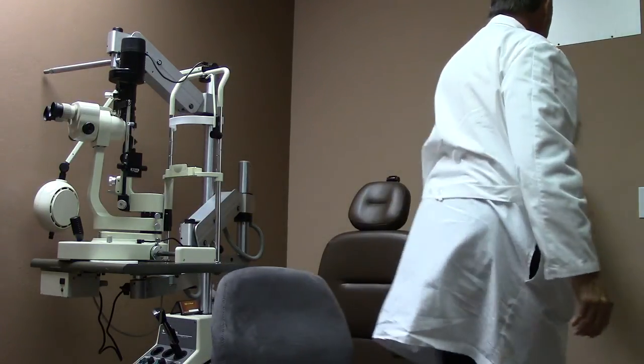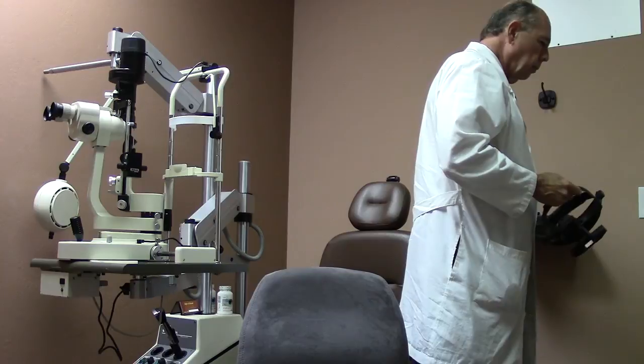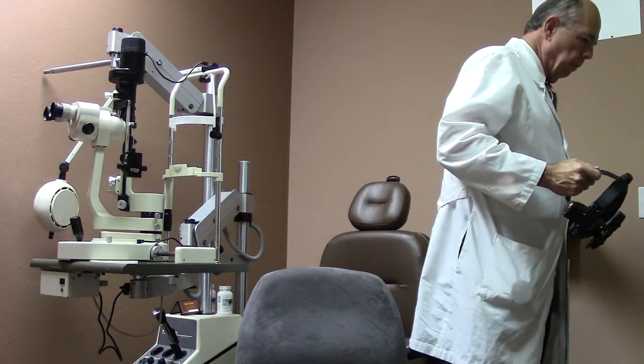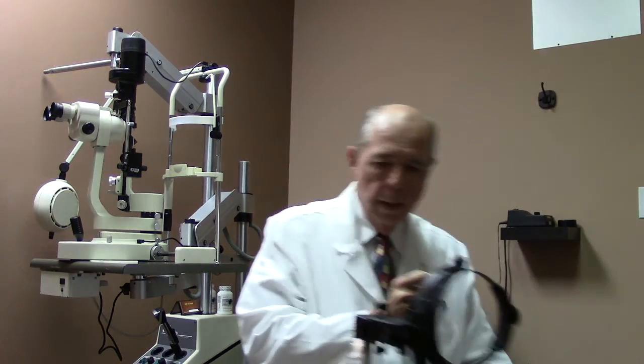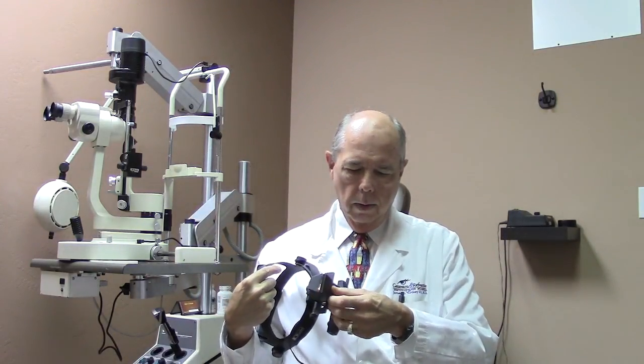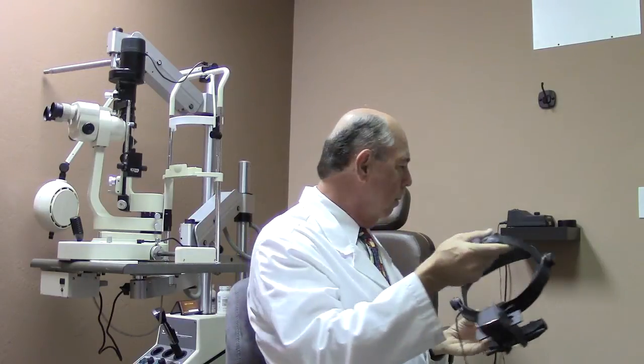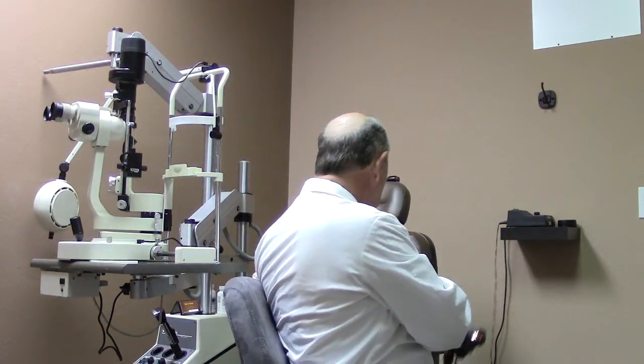The other instrument we use to examine the eye is called an indirect ophthalmoscope. This light shines inside your eye, and then we use a lens to examine the retina. When we put it on our head and look in your eye, this instrument allows us to examine all the way out to the edge of your retina — way out to the periphery inside your eye.